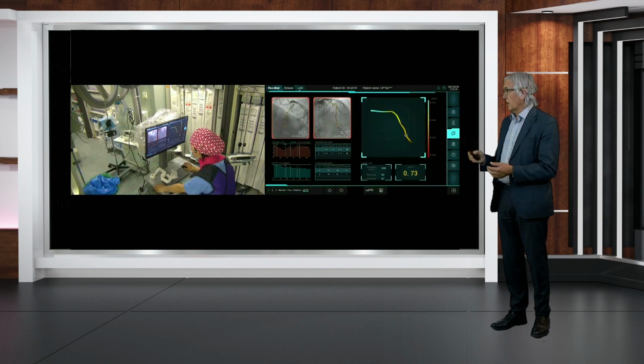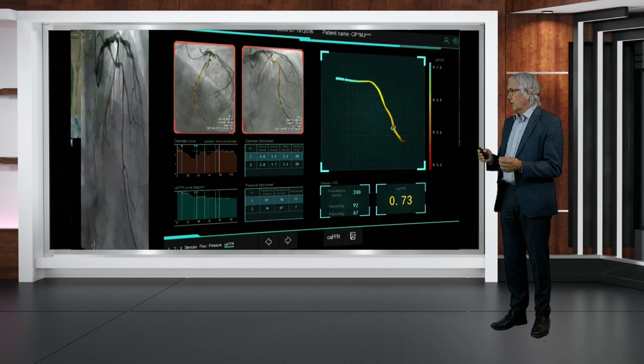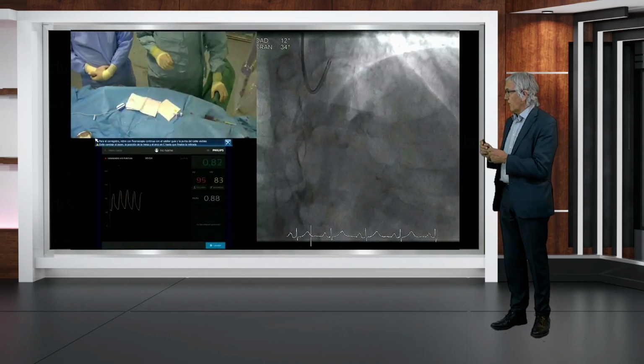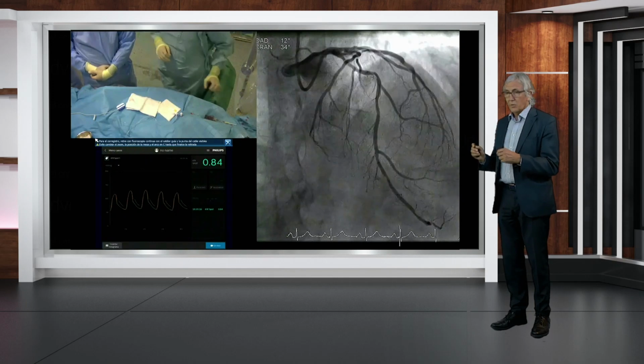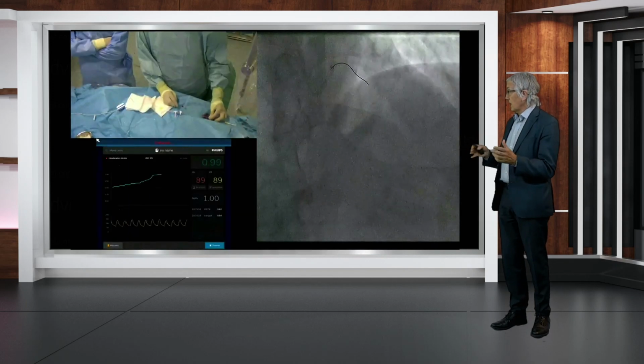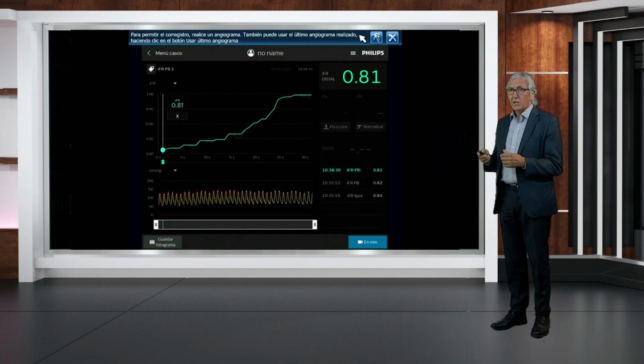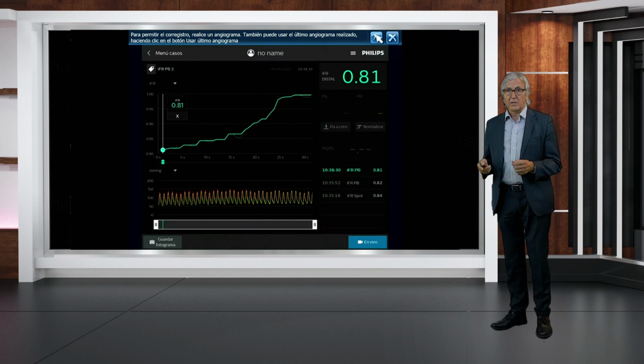You will recognize many features that have something in common with the use of pressure guide wires, but you will also realize that you have distinct advantages of having co-registered, so to speak, the physiological information obtained in the coronary arteries with the anatomy, favoring subsequent actions and perhaps decreasing the possibility of geometric mismatch.